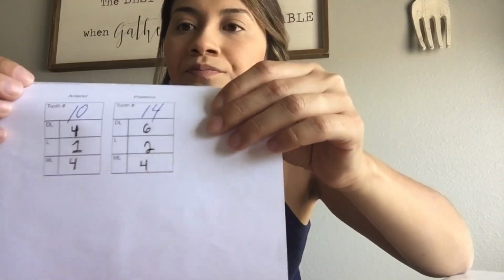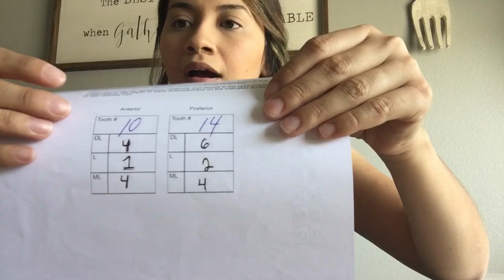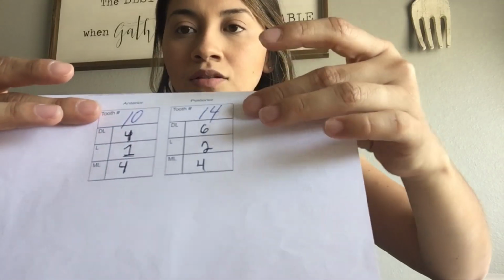During my examination, guys, the way that they do the probing exam is that the examiners assign 2 teeth to you. In my case, they assigned tooth number 10 and tooth number 14, so 1 anterior tooth and 1 posterior tooth. And they give me a little box like so. The surfaces are distal lingual, lingual, and mesial lingual for both. You have to write in your probing, and then you turn that sheet in. At the end, I believe they return all of this to me, because this is my actual paperwork from my examination.